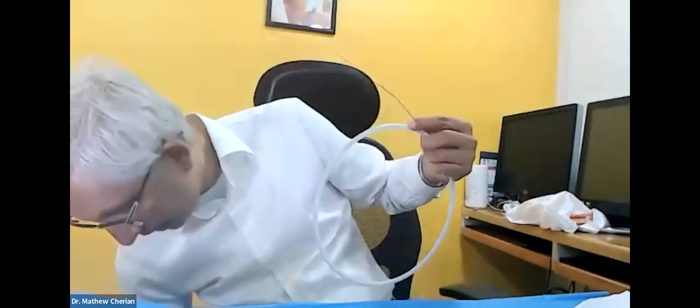Now, if you looked at the previous J wire, if you put it straight, it would not remain like this. I'm just going to show it again. This was the J-tip wire. And if you look, the tip is very soft. You just touch it and it bends. But whereas this wire, you see, it's really stiff. So this is called the Amplatz extra stiff wire. It can have a tip that is straight. It can have a tip that is J. It can come in a standard 150 length. It can come also in a 300 centimeter length.